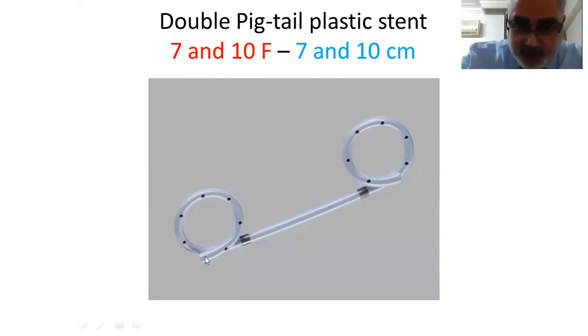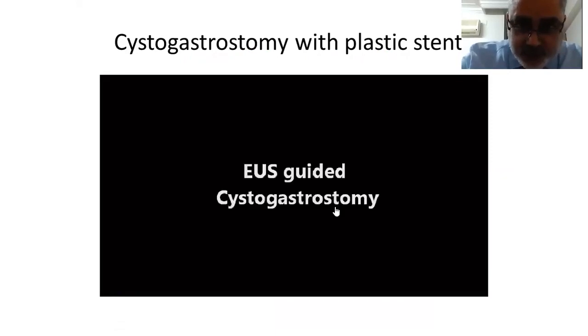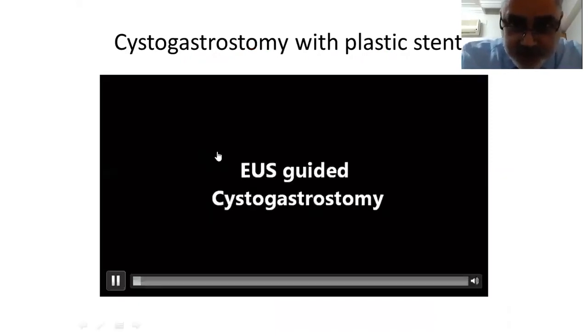It should be double pigtail to prevent migration of the stent, either inward migration inside the cyst or outward migration in the stomach. Then let us see this short video about the maneuver itself. And I'd like to thank my dear colleague, Dr. Ahmed Zamzami, who helped me in preparing this video.